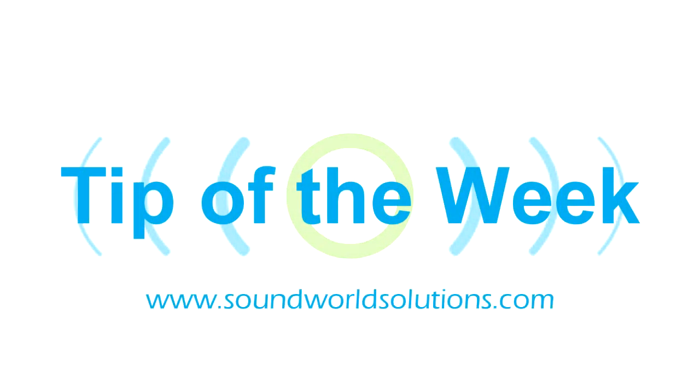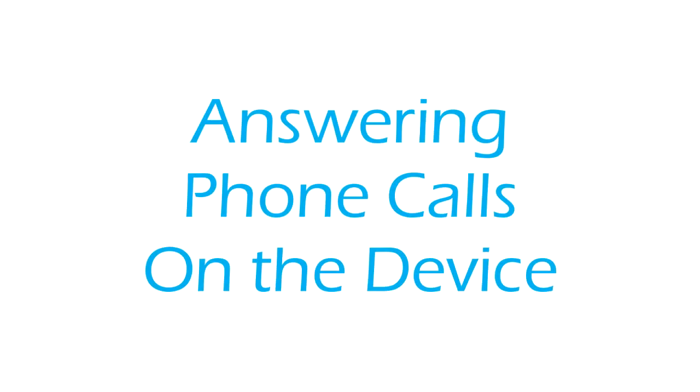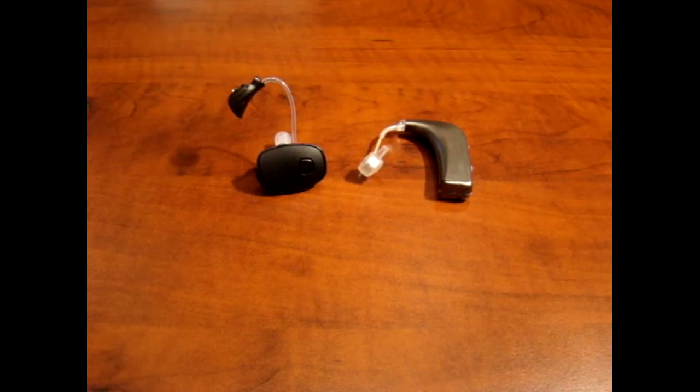Welcome to SoundWorld Solutions Tip of the Week. Today we will discuss how to answer and end a Bluetooth phone call on the different devices. We've had this question asked by some of our customers.